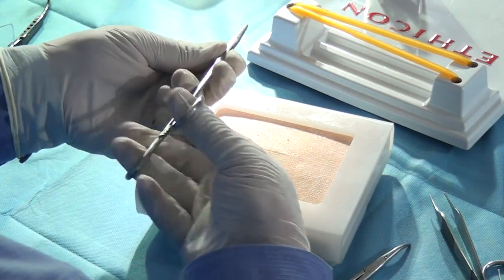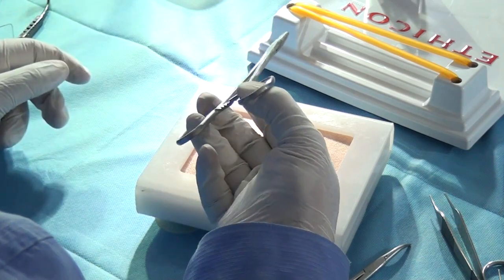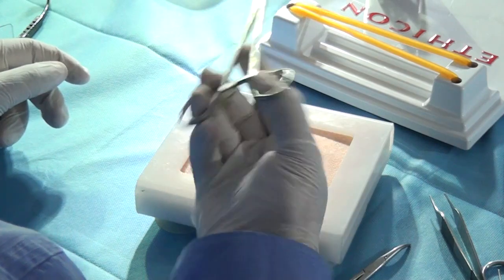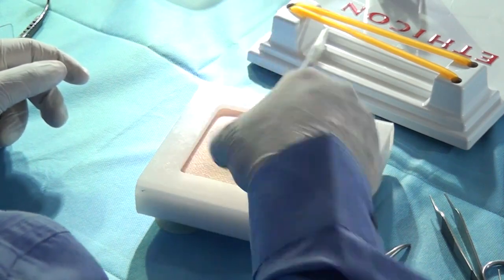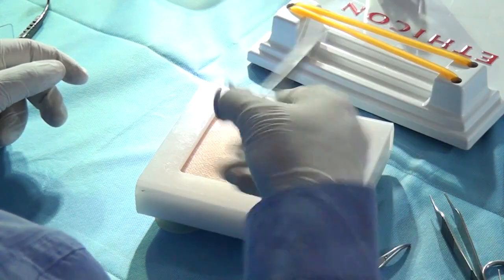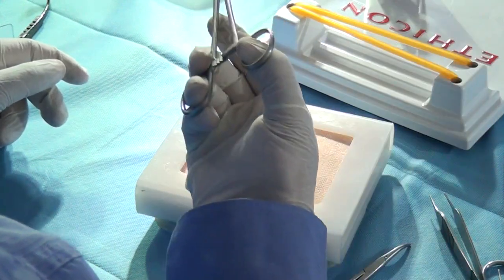You should control the instrument, so get to the tip. You can be out of it whenever you want. You control it. And now what is moving? My elbow. Pronation, supination, pronation, supination, pronation, supination.